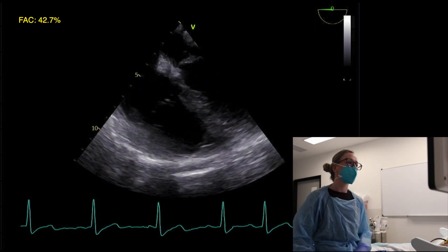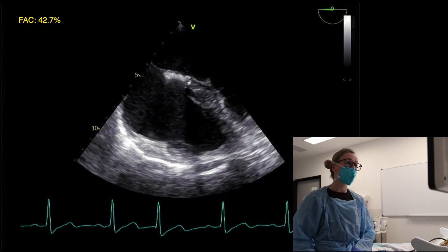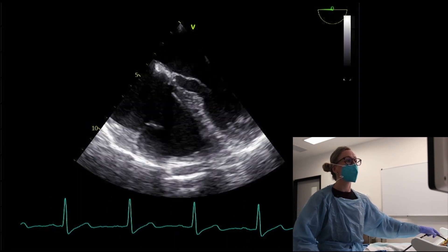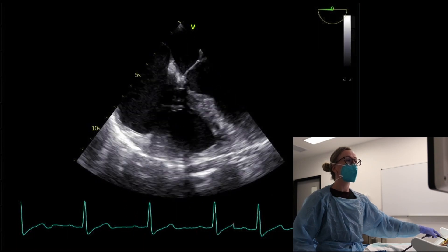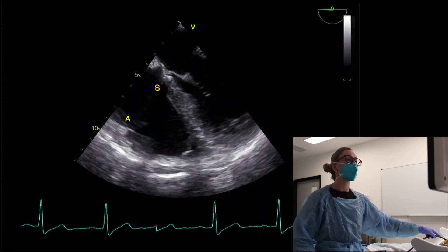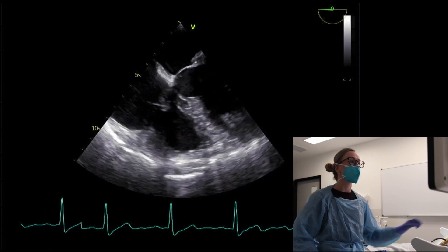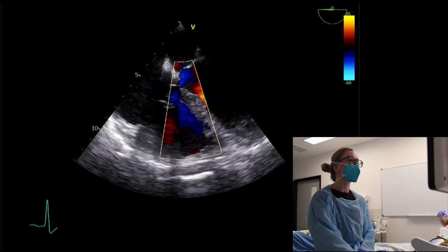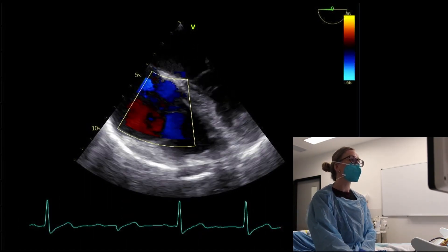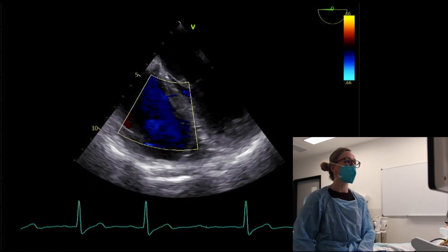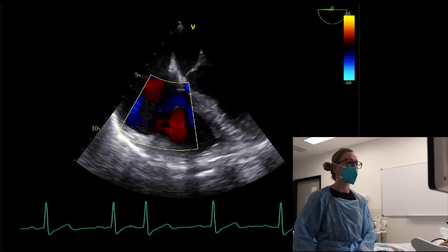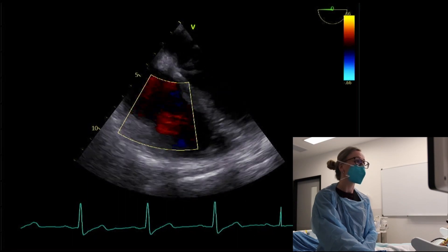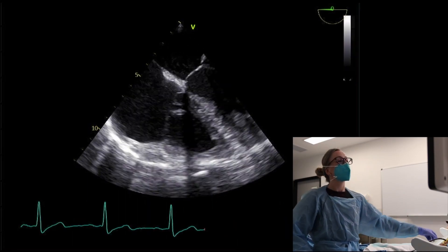Other simple things we can do when assessing right ventricular function is to assess the tricuspid valve — looking at whether it's thickened and how it's coaptating. We're probably seeing the anterior and septal leaflets here, though it's difficult to know exactly which leaflets we're dealing with. The key thing we want to know is whether there's any significant tricuspid regurgitation, so I'll pop some color over that and rotate through to check.